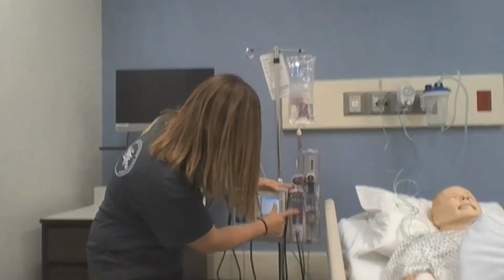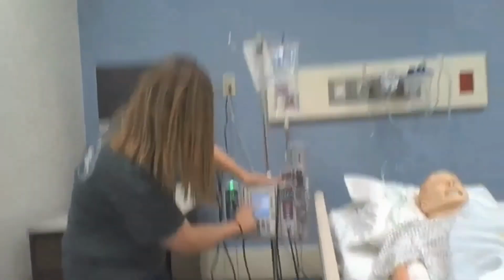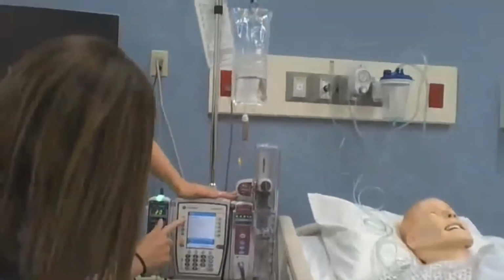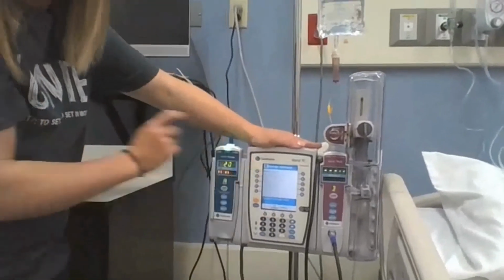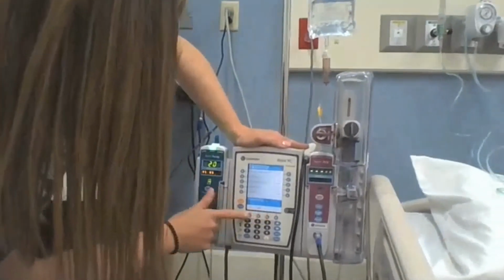So we're going to hit channel select here, and we're going to turn the key to the program position that's telling us to do that on the Alaris. It's having us verify the date and the time. So the time of day is 1:15. I'm going to hit confirm here. It's asking, is it a Monoject 35 ml syringe? I'm going to hit yes and confirm.